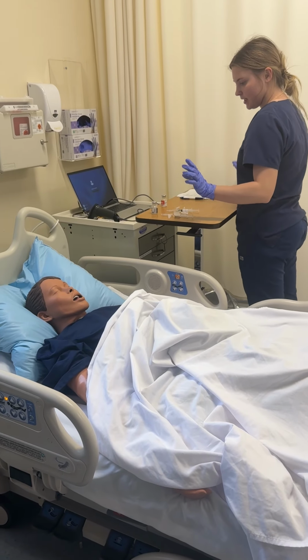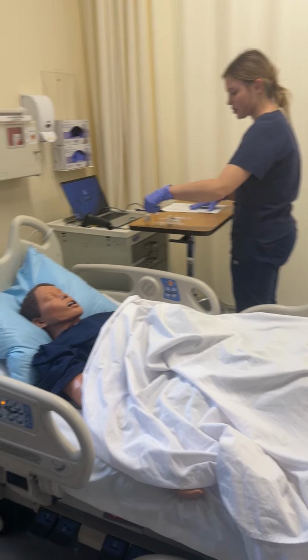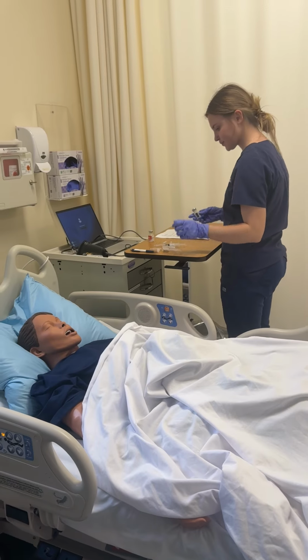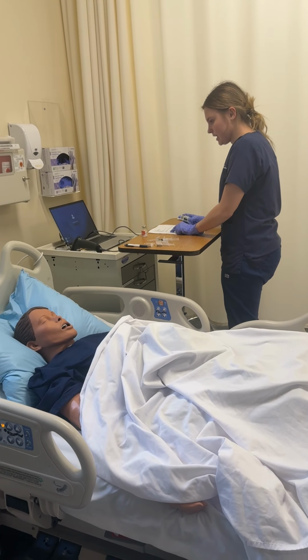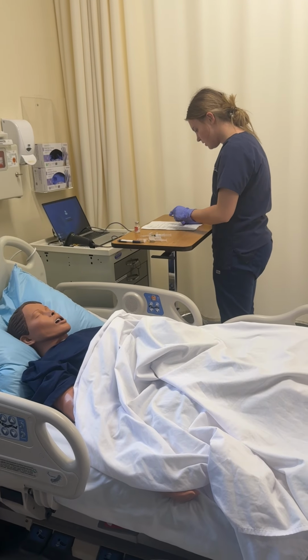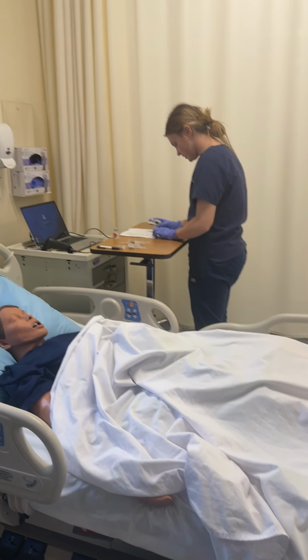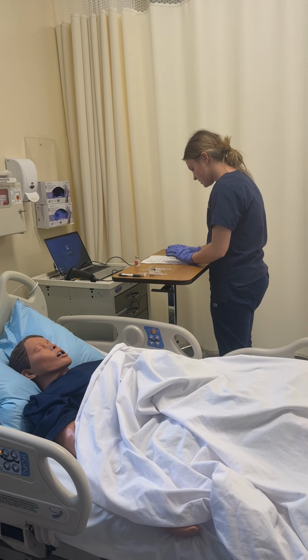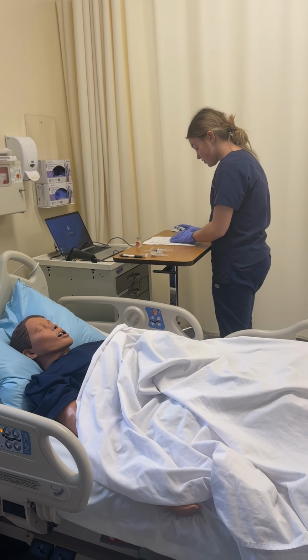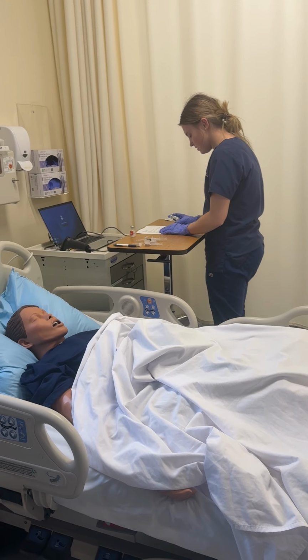So we're gonna complete our third med check here for the Fluzone. So we have Fluzone, which is indicated for preventing the flu. 0.5 milliliters for Sam Johnson. It is an IM injection that is due now because it has not been given this year.